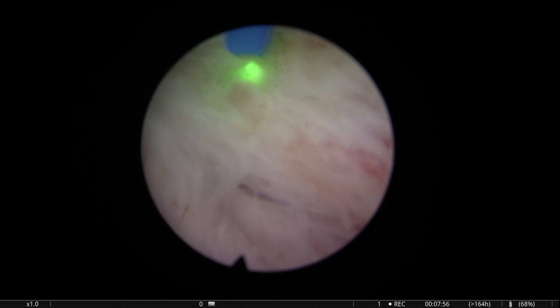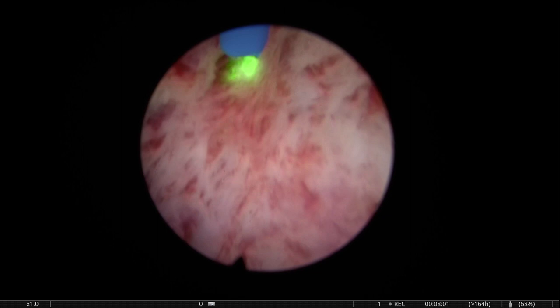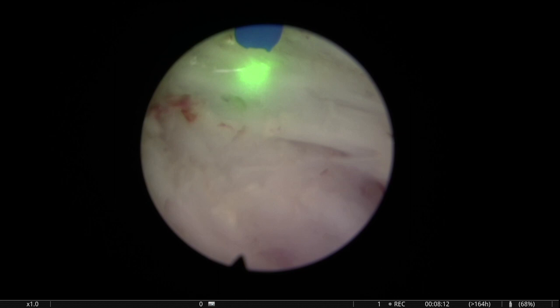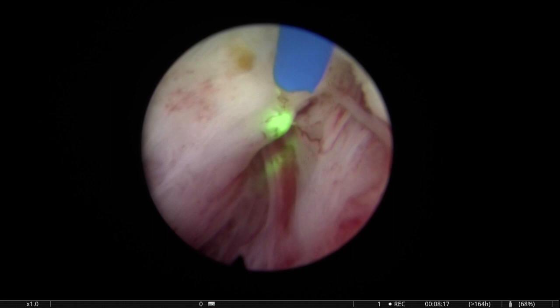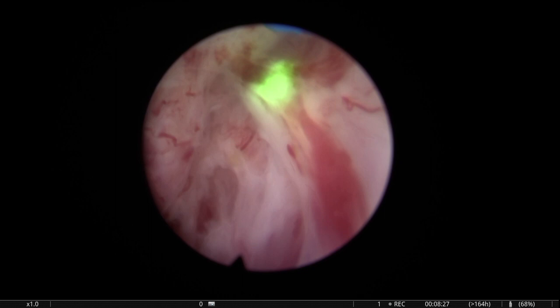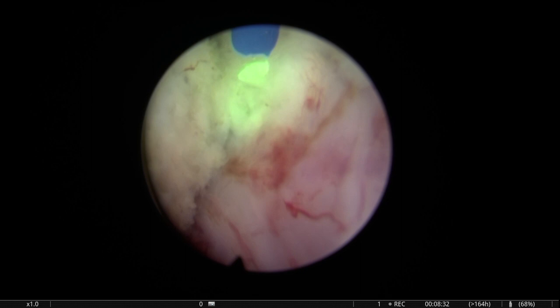And then, of course, as you get a little bit deeper, a little bit more proximal with your dissection, you start to have to look up, because one of the difficult aspects of early apical liberation is to reach the anterior plane, conquer the anterior plane, communicate the ascending dissection we're doing from one side. Look, this is the same nodule on the other side. You see? Symmetric. So initially I was cutting through here, but I recognized the nodule, and we will go back to rescue that.